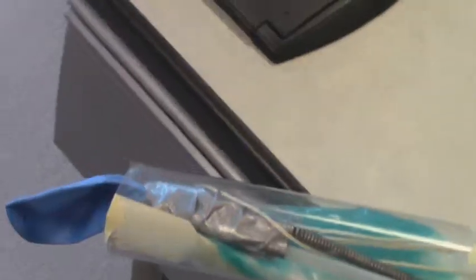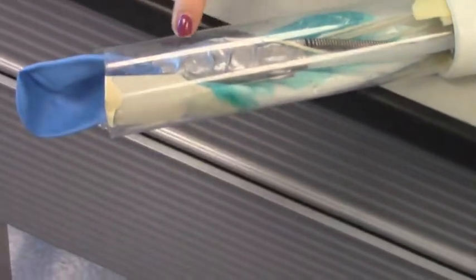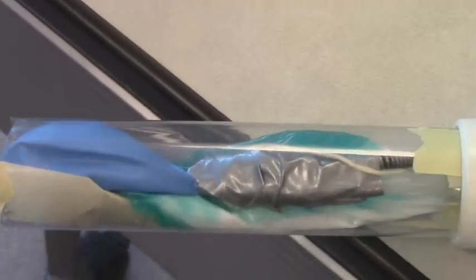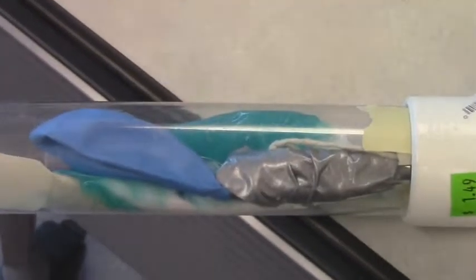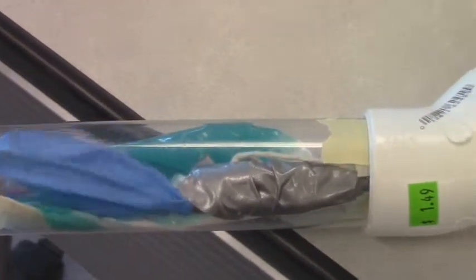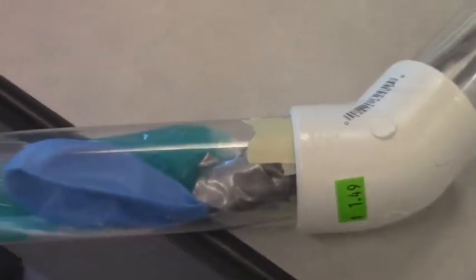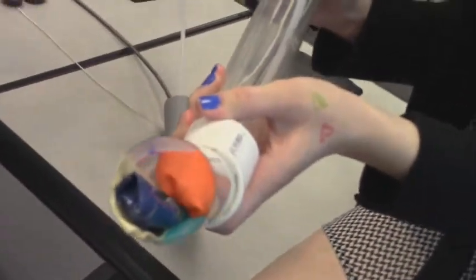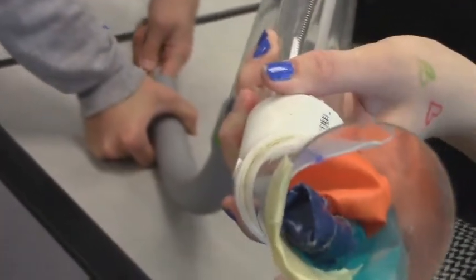It's easiest if you start with the balloon at the far end of the blockage and then inflate, pull back one inch, inflate, and repeat that process until the blockage has been flattened out into the plastic bag. By this point we have probably been working for over an hour and everyone's excited and relieved to have solved the problem — it can get a little frustrating. Here is a side view, and then we switch to an end view. You can see the snake on the lower left and the balloon on the upper right, and the balloon is wrapping around the snake to flatten out the blockage.